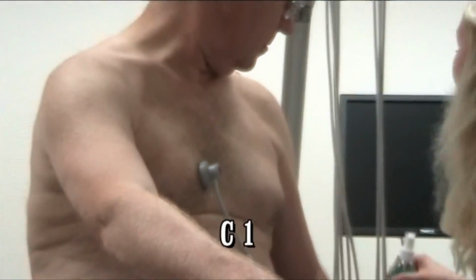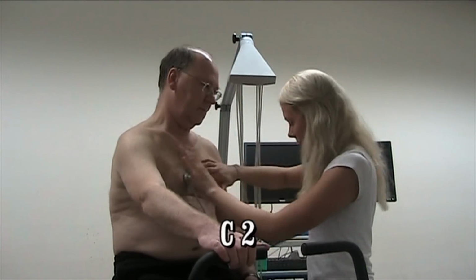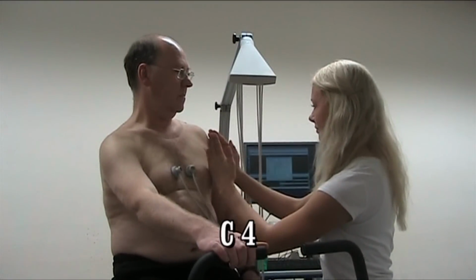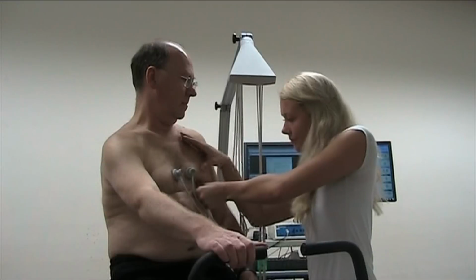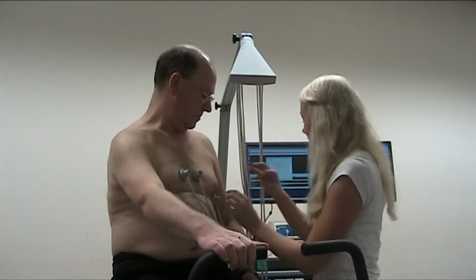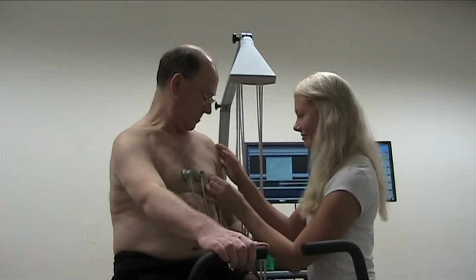C1 goes on the 4th intercostal space under the clavicula on the right side of the upper body. C2 is applied on the same location but on the left upper body. C4 is applied under mid-clavicular line, 5th intercostal space on the left side of the chest. C3 is then applied in the middle between C2 and C4.